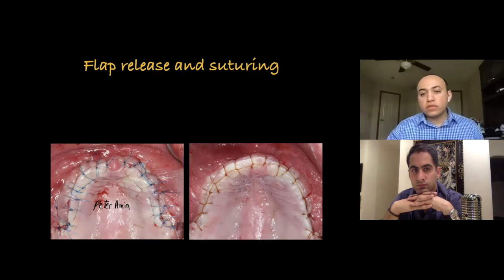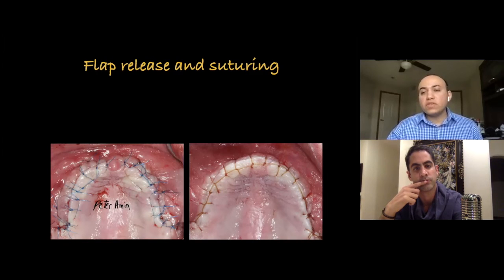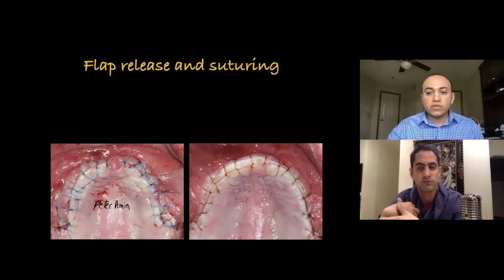On the right side, I was in the second stage. There was no reason to use something like polypropylene. So we opened with the implants. We didn't need to release the flap because we didn't add any more bone. We just removed the titanium meshes and placed the implants. I used continuous interlocking suture with chromic gut. If I had used the same suture for the first surgery with the GBR, I would have had a big failure and exposure of the membrane. So we have to understand what sutures to use and what to expect. Does the surgery involve a lot of swelling, like most GBRs do? Then I expect the sutures will be torn away if there's any kind of stress on the flaps.